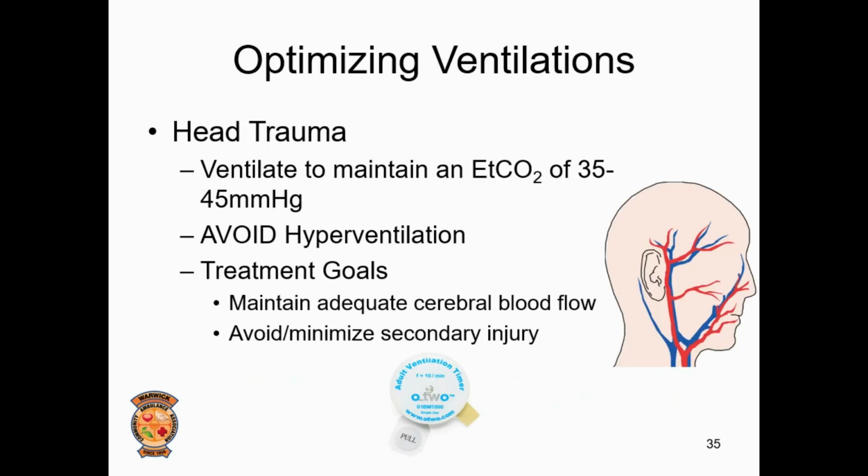What about the patient who is intubated but still has a pulse, specifically those with a head injury? A patient with a head injury and some type of intracranial hematoma is at risk of worsening hematoma if their end tidal CO2 is too high. A high end tidal CO2 is associated with dilation of cerebral arteries, which could worsen the intracranial hematoma due to increased blood flow. Hyperventilation, on the other hand, is associated with at least a doubling of the death rate of patients with a head injury in the intubated patient.